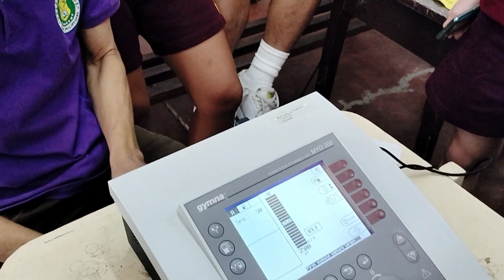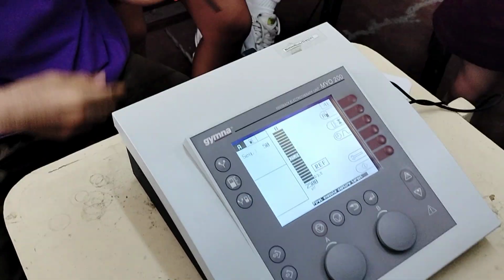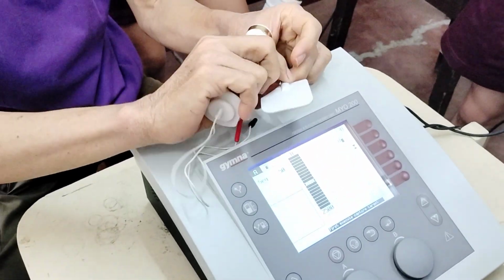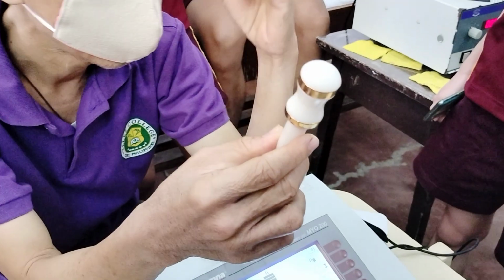But for pressure, this is the electrode being used. This would be connected to this one. You can remove it and connect it. So, here, you just imagine this.